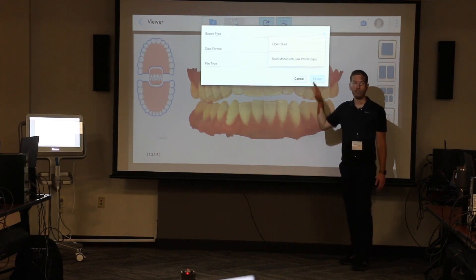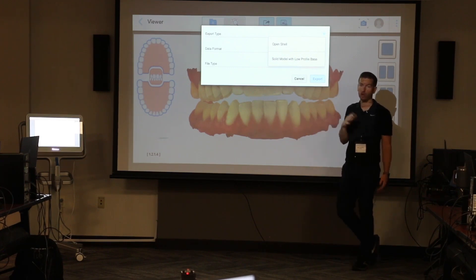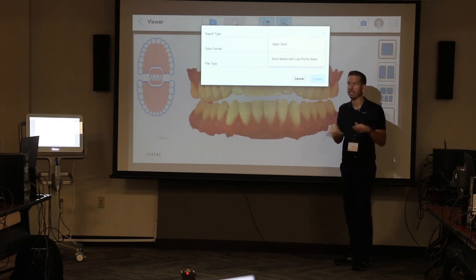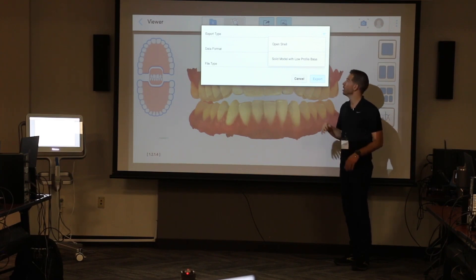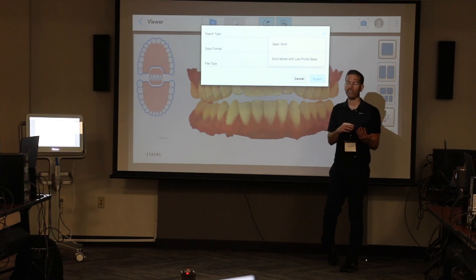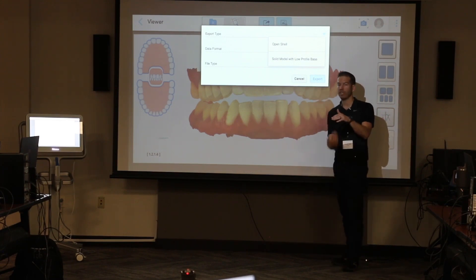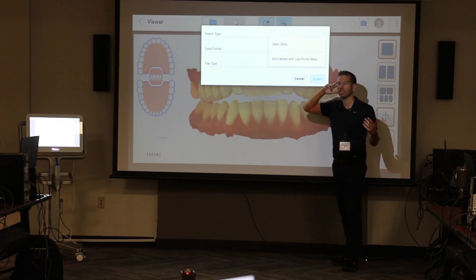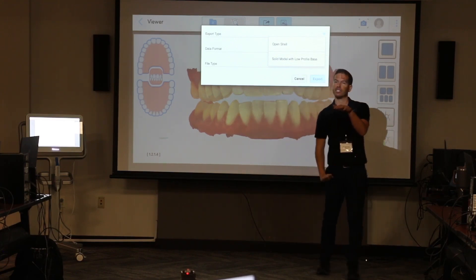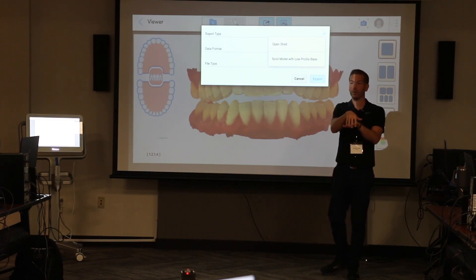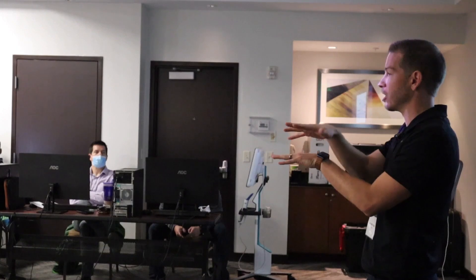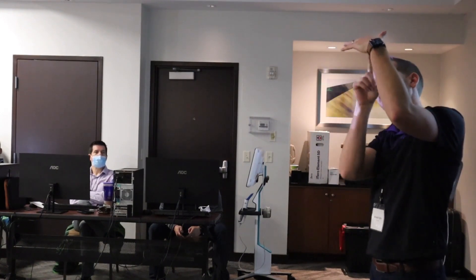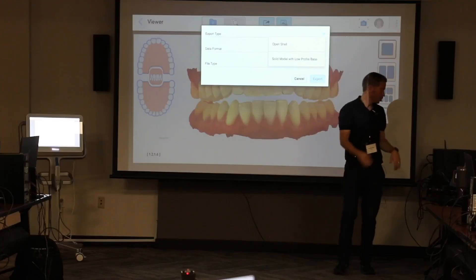If you're just downloading a model to print straight from your scanner — say for retainers — choose solid with a base so you can drop it on your printer ready to go. But if you want to manipulate that file, an open shell is helpful because you can see the contact points between two opposing models. It leaves a window underneath so you can see where teeth are touching during digital wax-ups and occlusion adjustments.